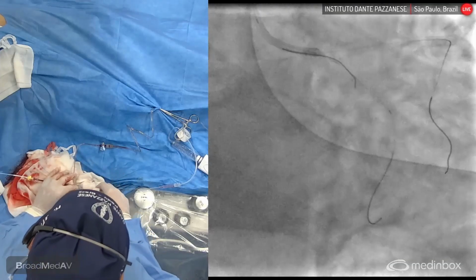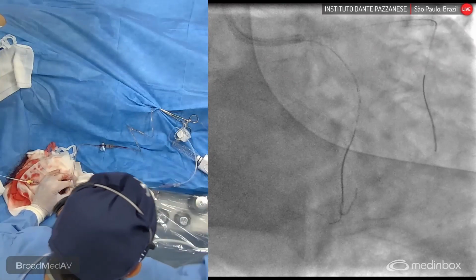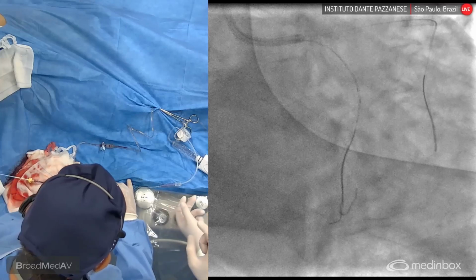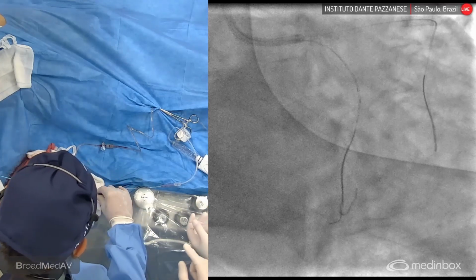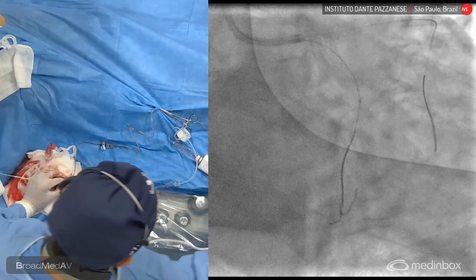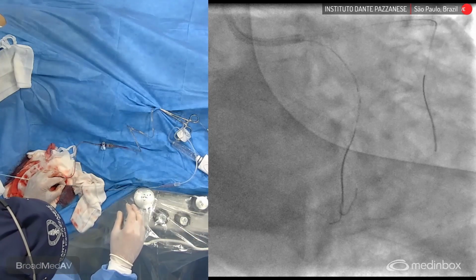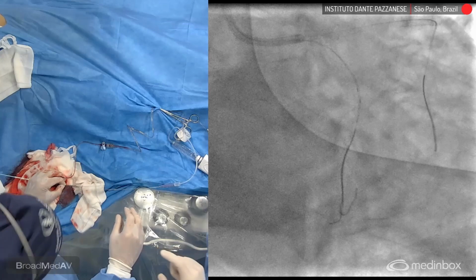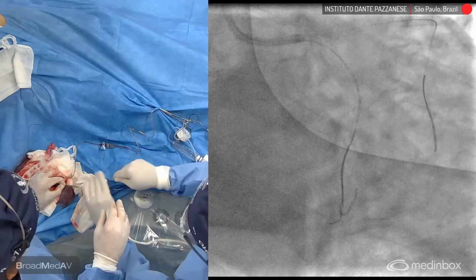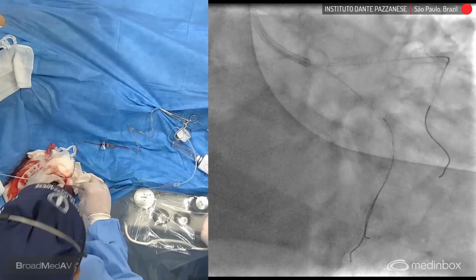So now it's advancing, and as you have more angulation at the tip of the wire, a 1.0 balloon gives you some work. So balloon 1.0. Rodolfo, what do you recommend in terms of the tip of the wire to recross such an angulation? It's like a secondary curve, a secondary 90 degrees type. What do you recommend? Two curves at 45 degrees, instead of exactly 90 degrees. So one at the very tip, and then one a little bit proximal. Perfect, that's what I like to do too.